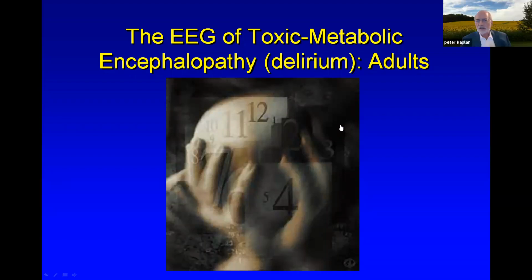Well, it is, in the sense that you can test the reactivity of the EEG, and it shows often whether the patient's brain, in effect, is reactive or whether the EEG alters spontaneously. And it gives you an idea also of how deeply compromised, and I showed you the schematic of the neuraxis, where the problem that actually is affecting the patient lies. You can have imaging that show all sorts of things at multiple levels, but the EEG reflects the most serious level.